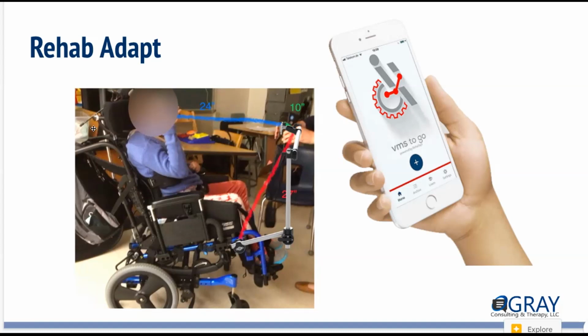One of the things that I have since learned that I very rarely see in the field is that this, where the bar drops in to the bar vertical and then the horizontal bar drops in, has to be perfectly level. So that's supposed to be level, and that's why it's coming out of adjustment, because if it's not level, there's constant pull on it. And I don't see a lot of people setting up their mounting this way.